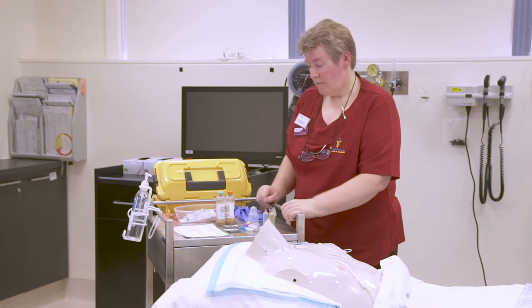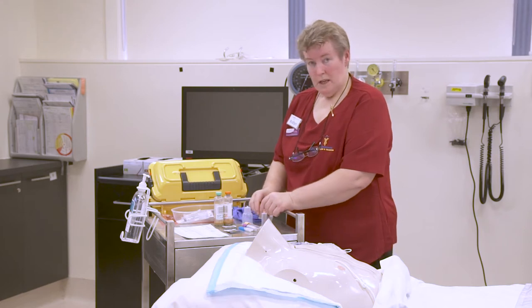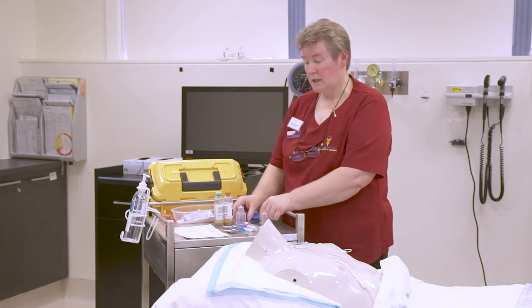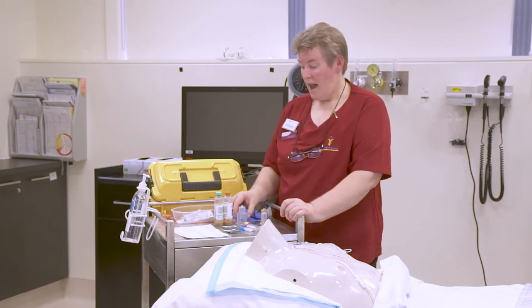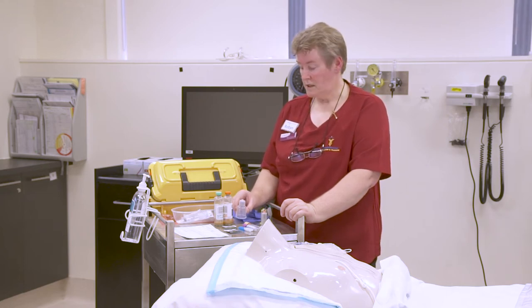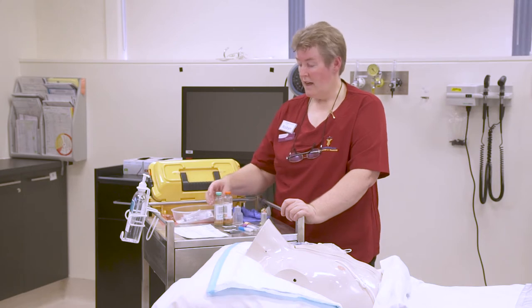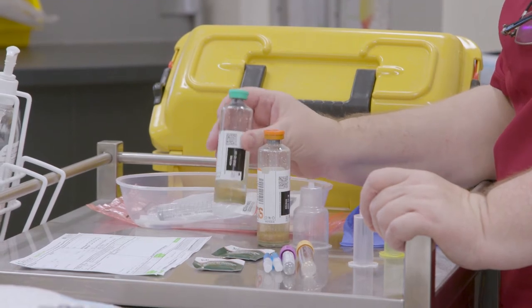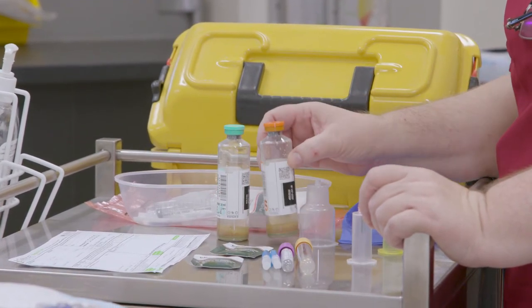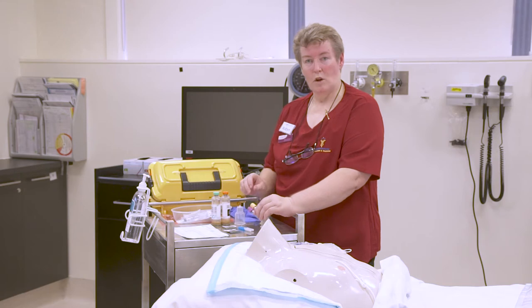So here on the trolley I have my pathology equipment. Now, depending on what has been ordered, we may need to collect blood cultures. In this case, of course, we'll need to bring our blood culture bottles and our corresponding vacutainer to size. They need to be collected first. And where we routinely take 5 mL of blood off first, that first 5 mL becomes our aerobic specimen. So don't discard, that becomes our first. Then we collect our anaerobic blood culture specimen, and then our other blood parameters depending on what's been ordered.